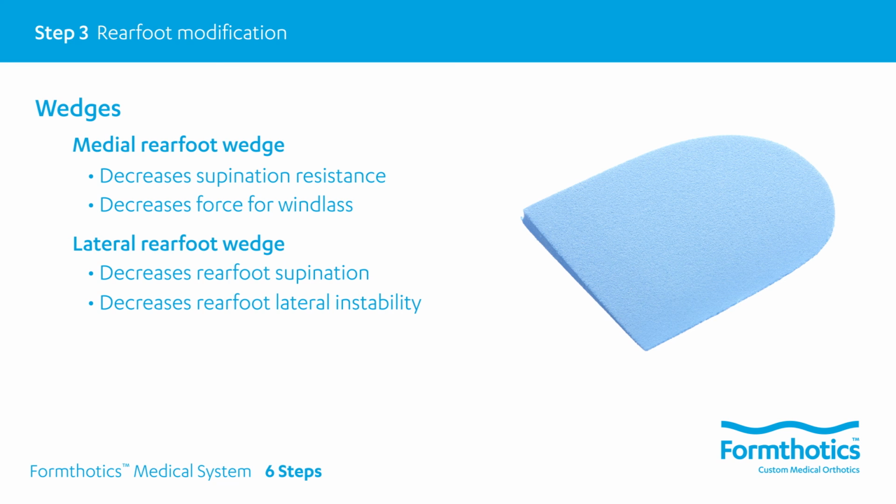Note that applying a lateral wedge to a supinator who has no rear foot eversion available is unlikely to create the desired effect of reducing rear foot supination alone. In this instance, a heel raise to manage a forefoot equinus and to improve functional ankle dorsiflexion, along with an extension of the lateral wedge into the forefoot, good laterally structured footwear and shoe modification may all need to be considered to optimize the outcome.